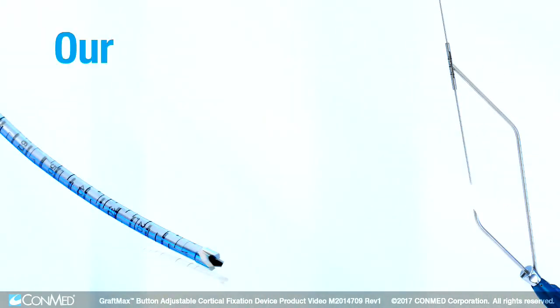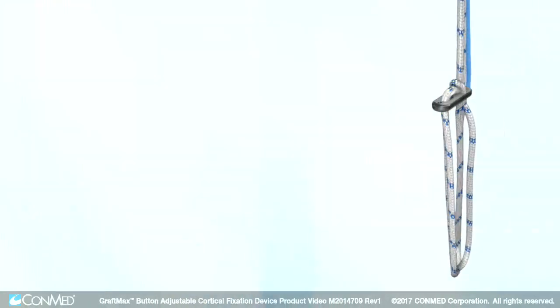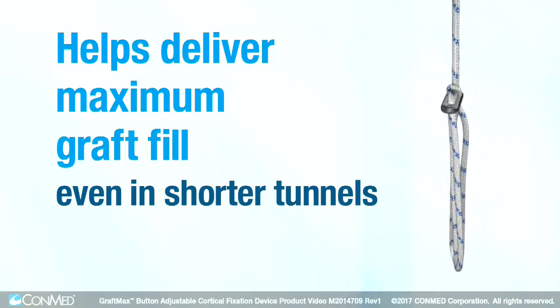Combined with our curved, flexible drilling system that helps provide precision placement of anatomic femoral tunnels, this button helps deliver maximum graft fill even in shorter tunnels.